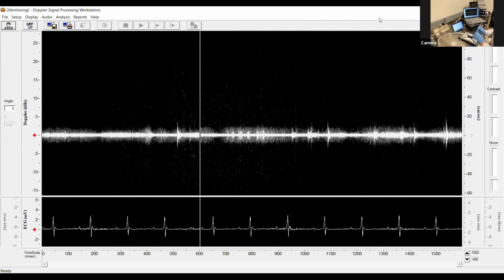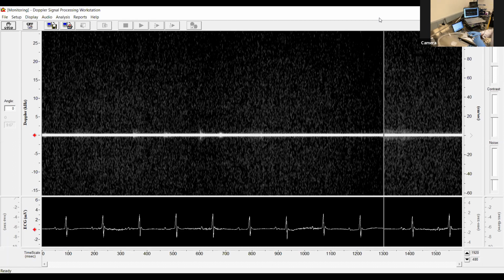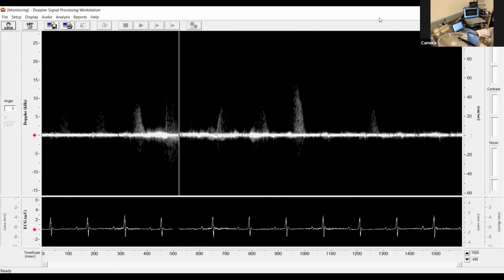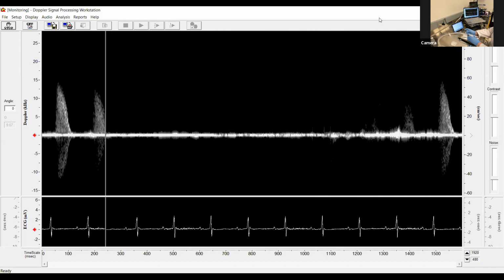Great, so I'm actually gonna have Sydney put down the other mouse. I'm fairly confident based on what we're seeing that this heart isn't in the place that we would normally expect it to be. And for the purposes of the demo and showing you the system, I would like to try our second mouse.